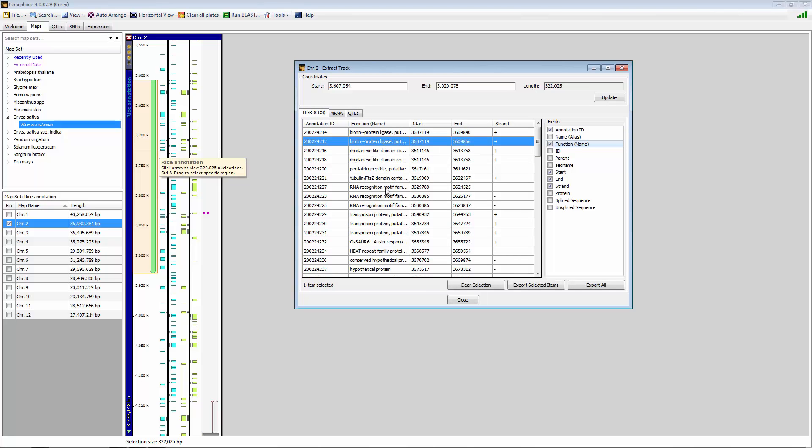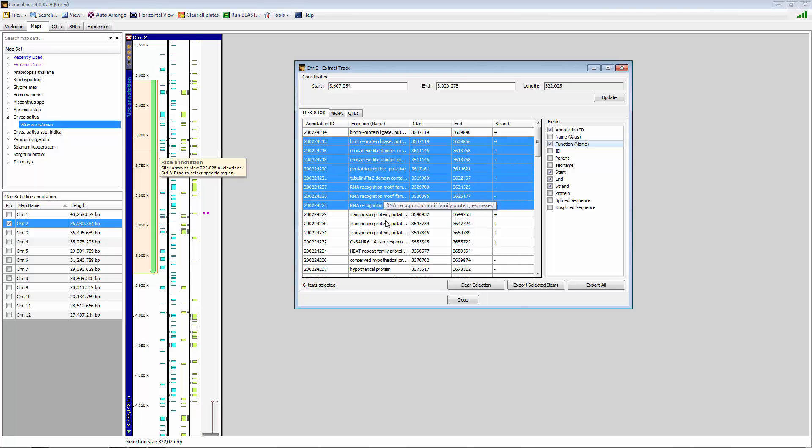You can select a few of these and export selected items, or you can export all. And once again, this all gets exported into an Excel file, which then you can manipulate in different ways as you'd like for different purposes.